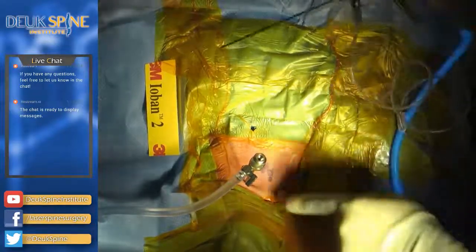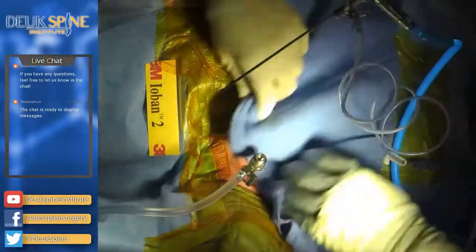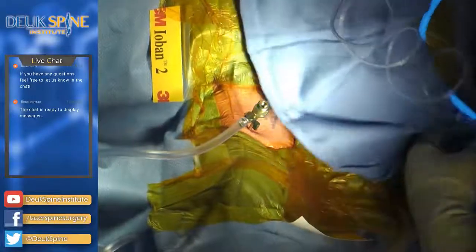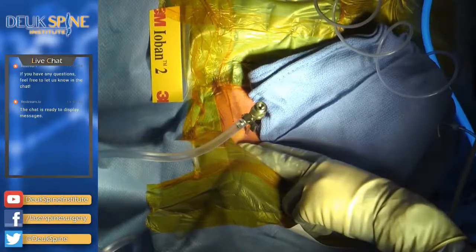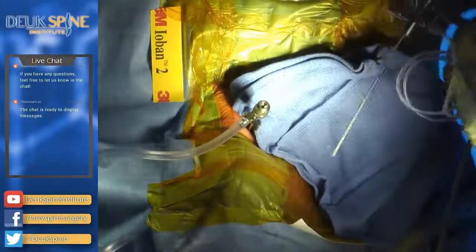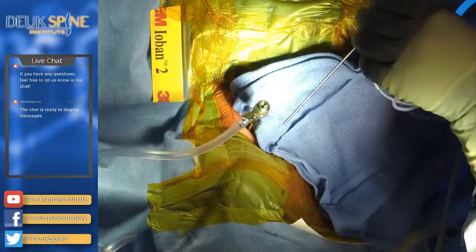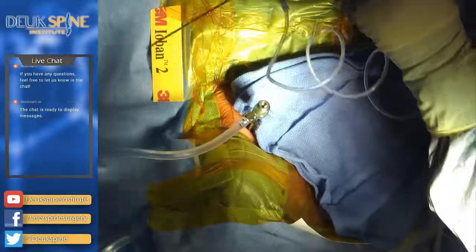All right, where's my blue towel that goes here? Good. Where's my wrist? Can you all see this here, Sean? The neck and how we've accessed through a small incision? We can. All right. Good. Let's advance the laser to the end where I want it. And you're going to wrap my wrist? Go ahead.